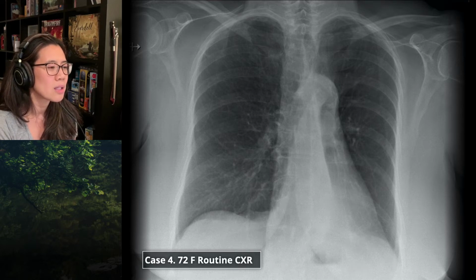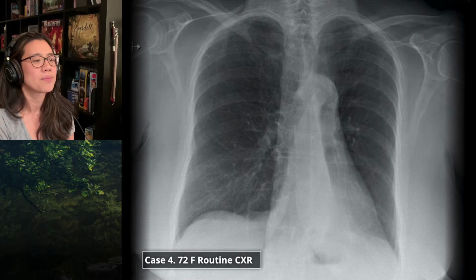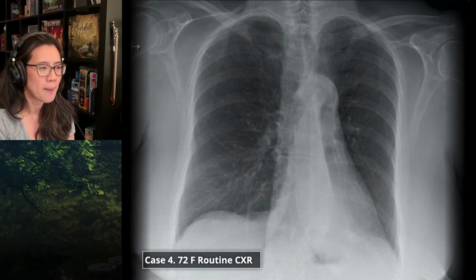No, sorry, I'm not trying to confuse you. Yeah, I fully agree with you. She does have left lower lobe collapse. Sorry. Yeah. Okay. Right. No, she does have left lower lobe collapse. Yep. And the reason I put it in there was not to show you the collapsed lower lobe, but to show you the hyperinflated left upper lobe, which gives you a small black hemithorax.